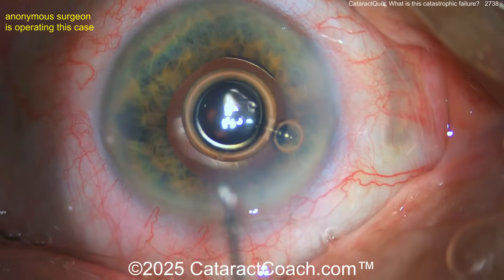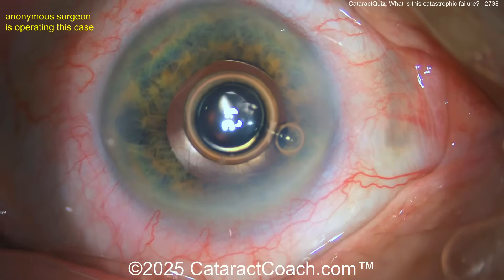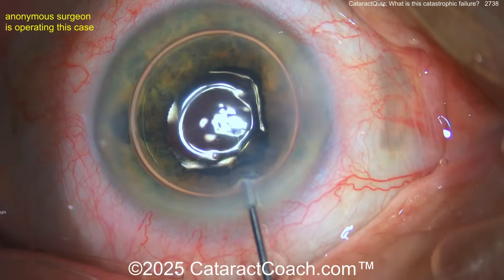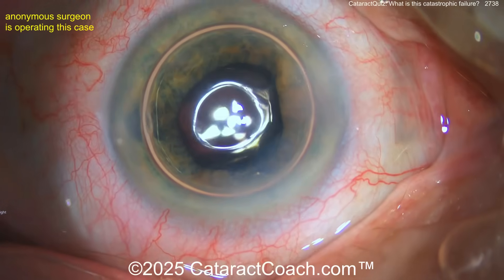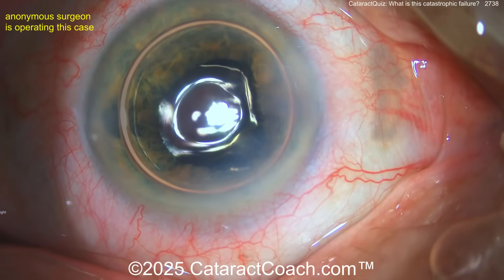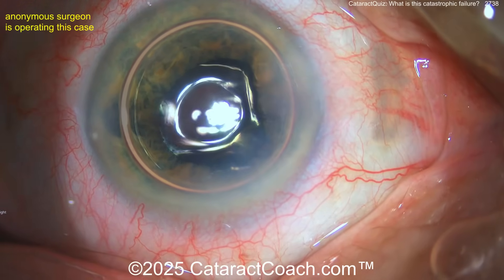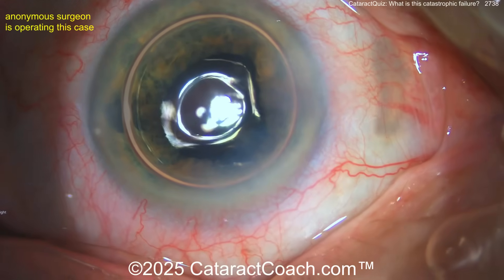You have to inject from the other side. Take the bubble out and then inject from the other side. The existing Descemet's membrane is okay if you can get it positioned right. But that's wrong — Descemet's membrane is underneath the bubble now. You want Descemet's to be above the bubble so the bubble pushes it up. You should have gone through the left-side paracentesis.